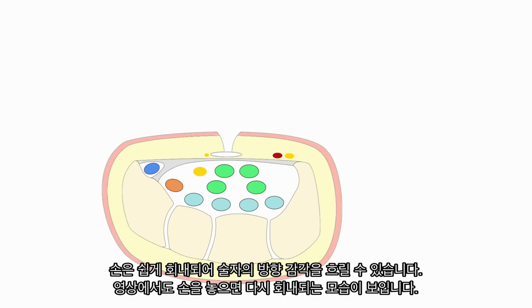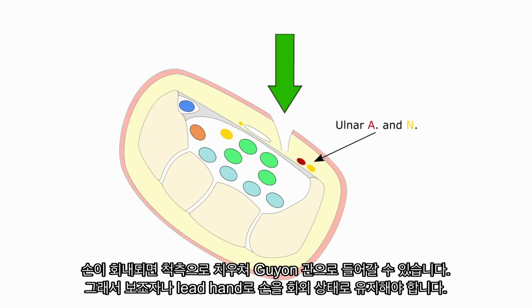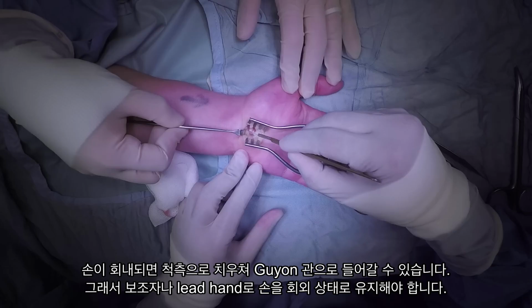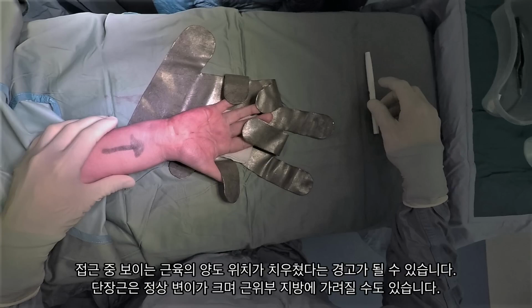Why is this an issue? Well, what we're trying to achieve is to travel vertically down into the carpal tunnel from our initial incision. With the hand pronating, you can very easily drift ulnarly and end up near the ulnar nerve and artery. What will usually happen is that when you start dividing the transverse carpal ligament proximally, you'll actually be entering Guyon's canal. To avoid this, first of all, be aware of it, and then use an assistant, such as your scrub nurse, to hold the hand supinated, or use a lead hand, as you can see here, where it's holding the hand supinated and the digits extended, with a swab under the MCP joints dorsally to provide some cushioning.